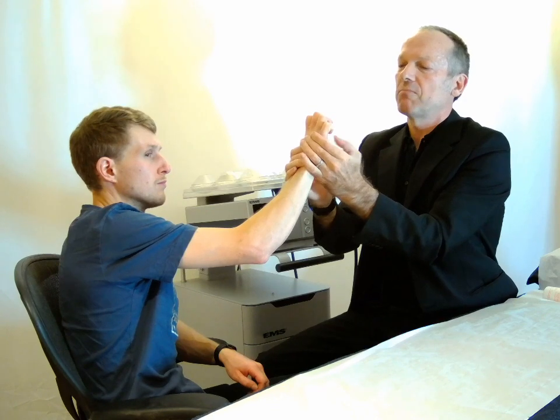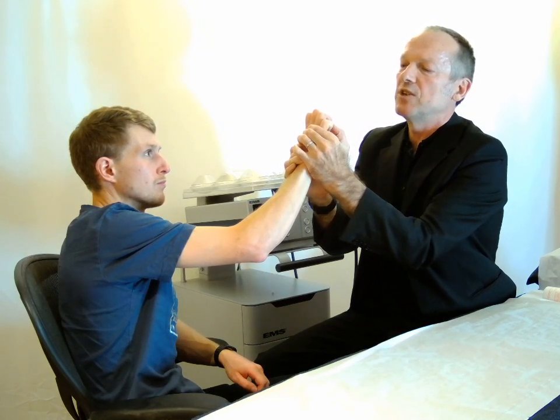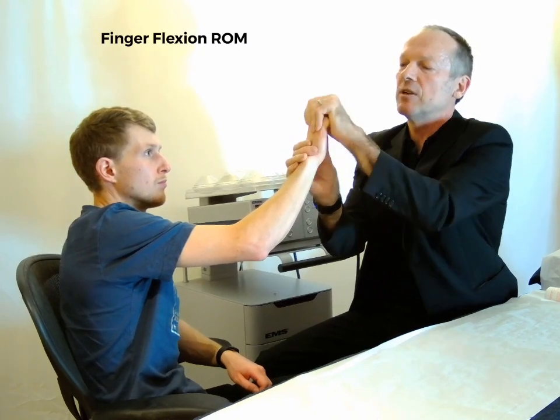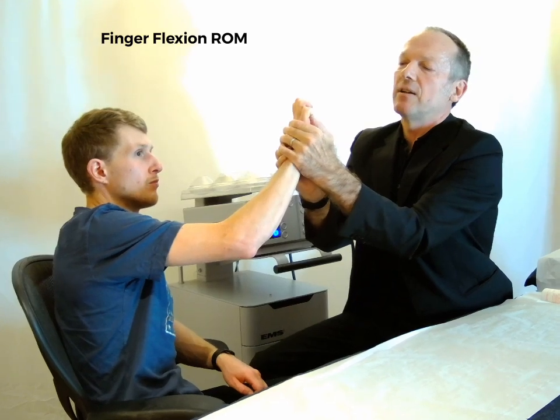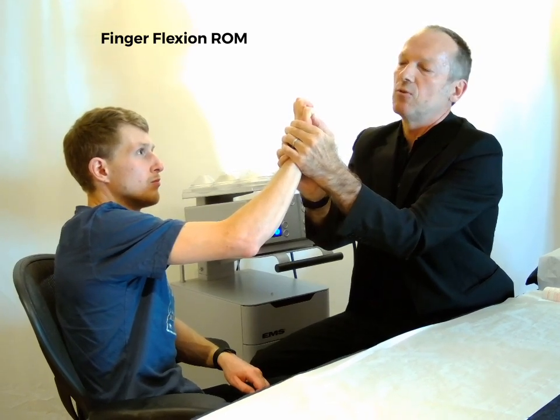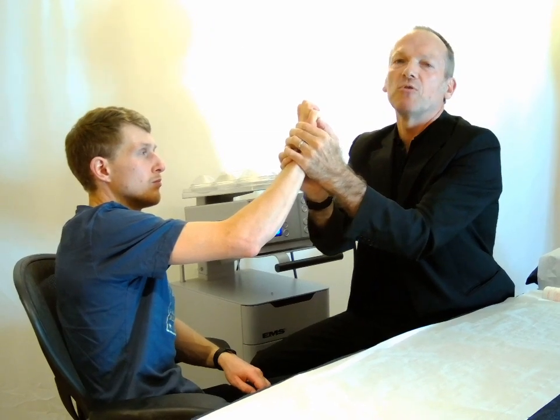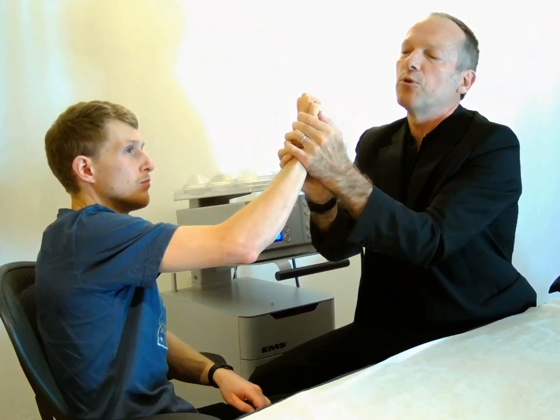One of the first things I look at with these finger injuries is the range of movement in flexion. So we have the MCP here in hyperextension and we see if the pad can oppose the distal palm, so that's holding there. When we first started treatment that range was not available, so that's significantly improved.